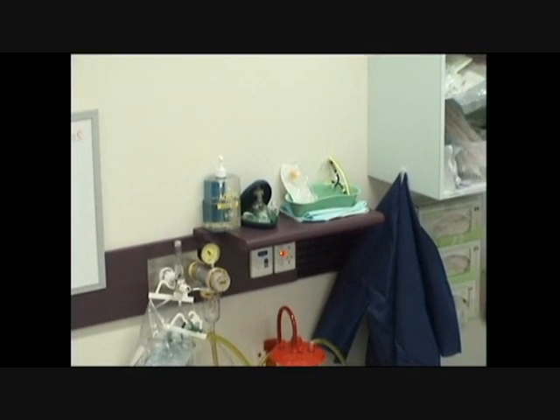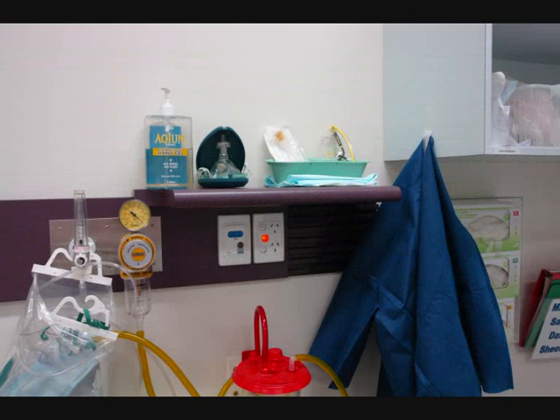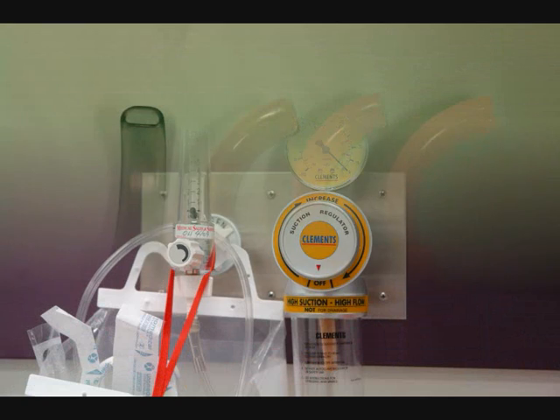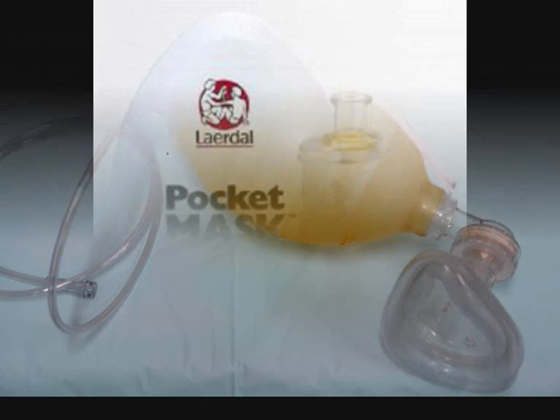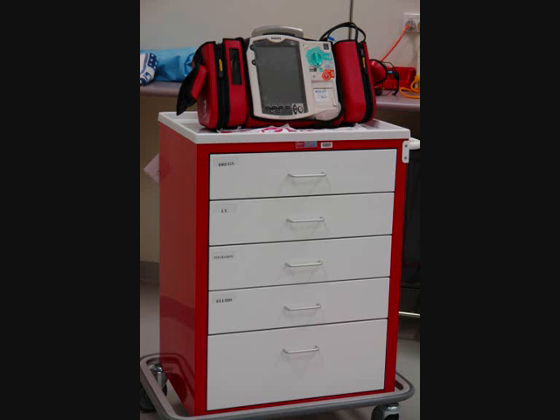At the commencement of every shift, it is your responsibility to ensure that you are familiar with the clinical environment that you're working in and the various types of equipment. For airway management, this may include checking the oxygen and suction, ensuring that there are various sizes of Goodell's available, that a bag and mask or air viva is present, and a pocket mask if available, and the location and contents of the resuscitation trolley.